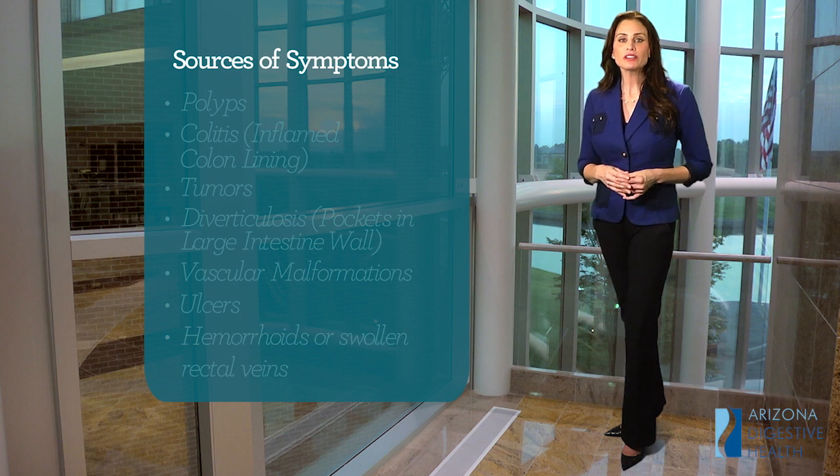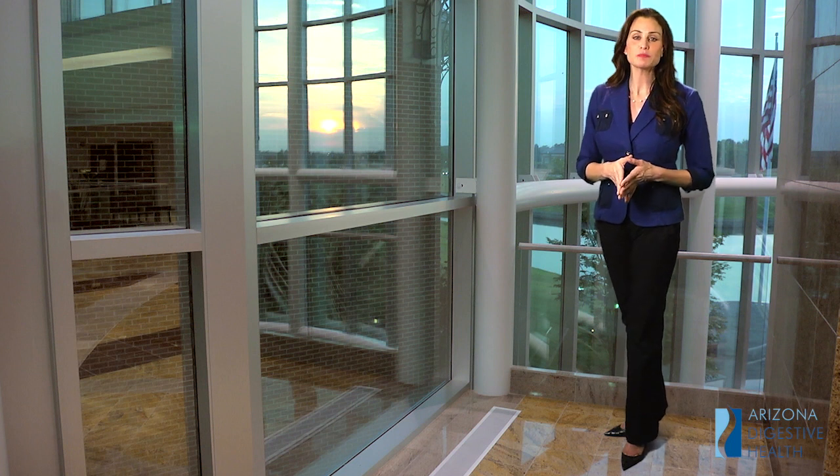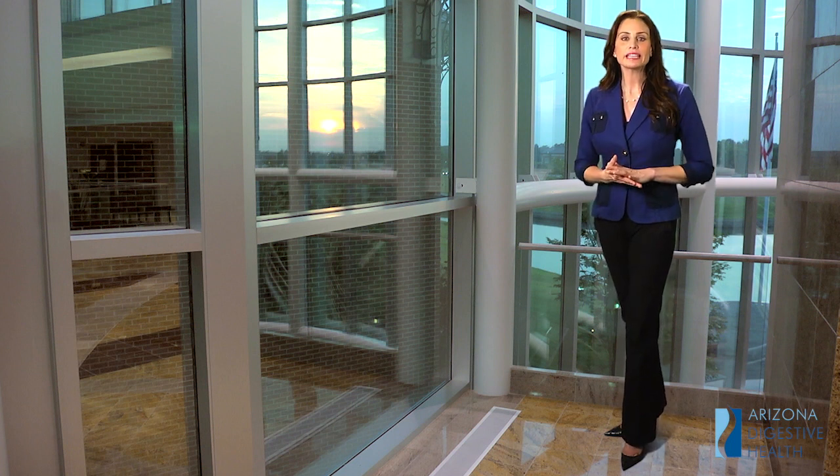If you've given prior consent, your doctor may treat any abnormalities seen during the exam. If found, polyps may be removed or a biopsy may be taken. There is no feeling inside the colon, so you won't realize this procedure is being done. Because the site can be seen so clearly, your doctor can determine if more tests are needed and develop a treatment plan for the diagnosis.